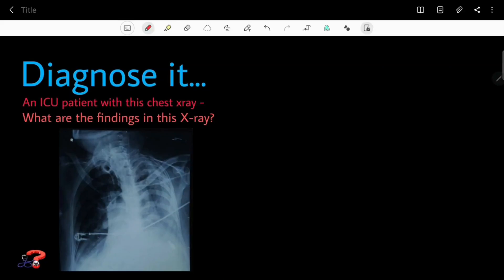Hello everyone, welcome to Diagnose It. Today we have this chest X-ray — this is a case of a patient in the ICU and we are to make a diagnosis from it. Discussing the findings: firstly, there is significant rotation present in this chest X-ray, so we can't make a very straightforward diagnosis. But there are a lot of wires visible over the patient.